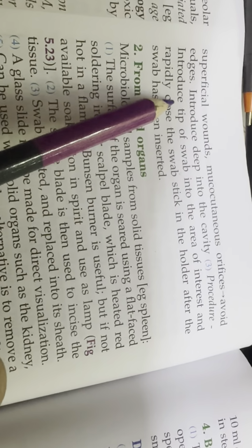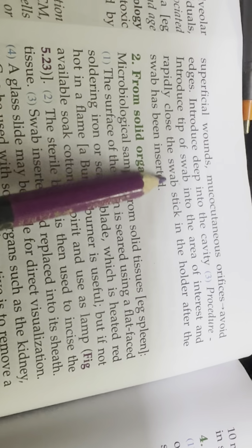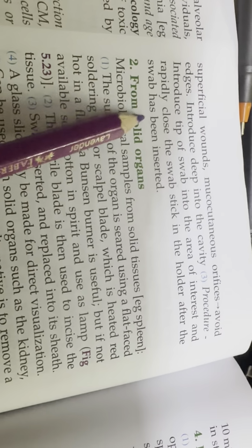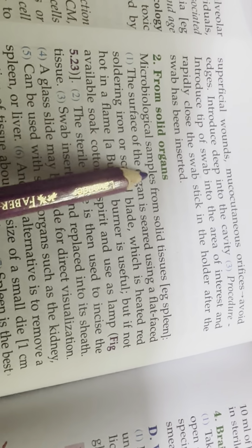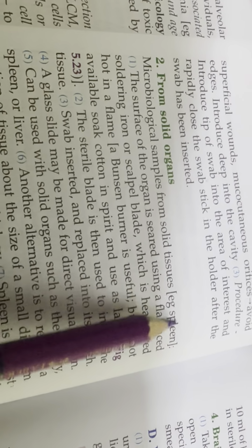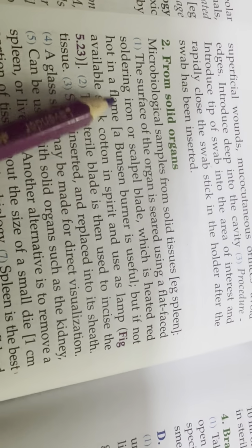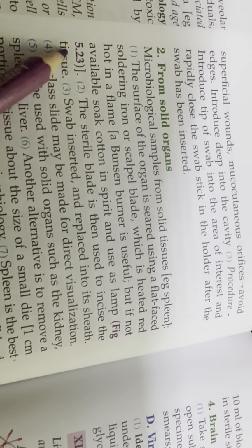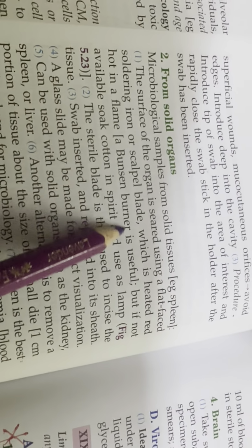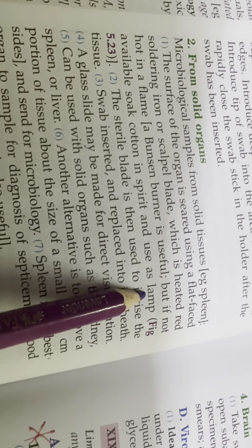Procedure: introduce the tip of a swab into the area of interest and rapidly close the swab, sticking it in the holder after the swab has been inserted. From a solid organ, for microbiological samples from solid tissues, for example the spleen, the surface of the organ is seared using a flat-faced soldering iron or a scalpel blade, which is heated red hot in a flame. A Bunsen burner is useful, but if not available, soak cotton in spirit and use it as a lamp.